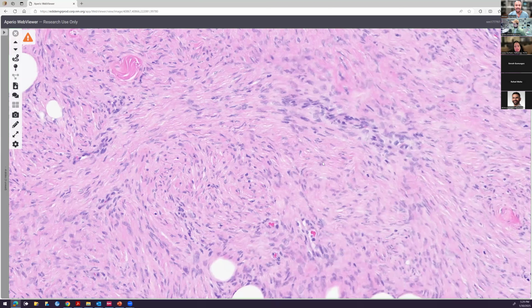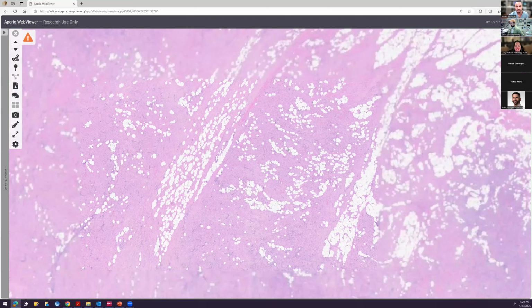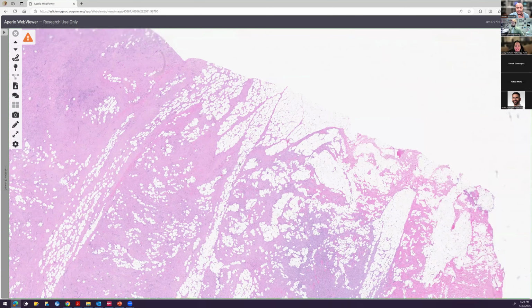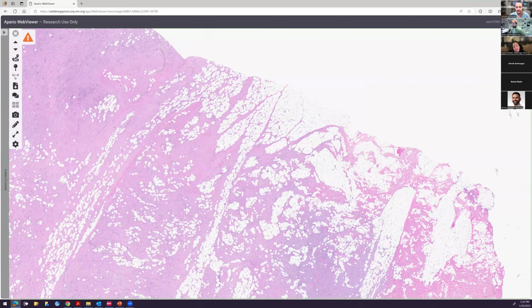Okay, given that it's a superficial cutaneous lesion with some entrapped fat, it has this storiform architecture. And then the entrapped fat itself looks like a honeycomb. So putting all these things together, I think of dermatofibrosarcoma protuberans, DFSP. Yeah, okay, that's correct, and that is exactly what we're looking at here. You mentioned exactly what we were talking about. This pattern of infiltration is called honeycombing or septal-type infiltration into the fat. That's very typical of DFSP.